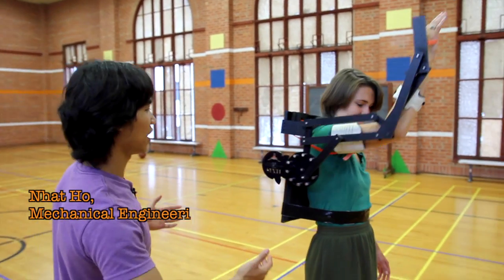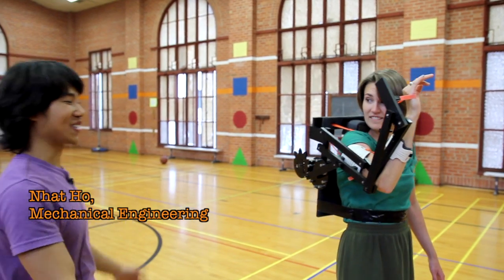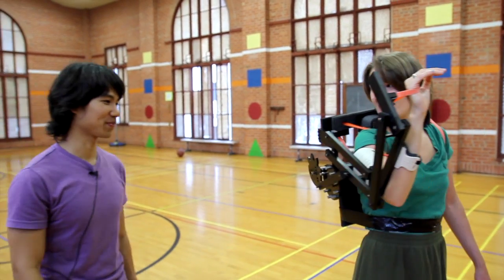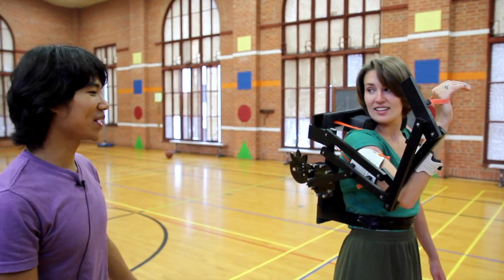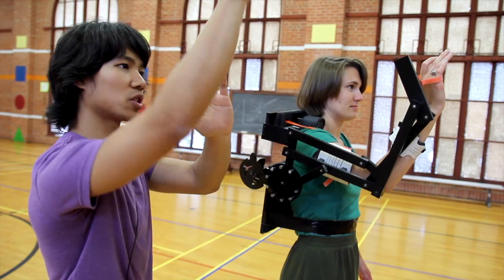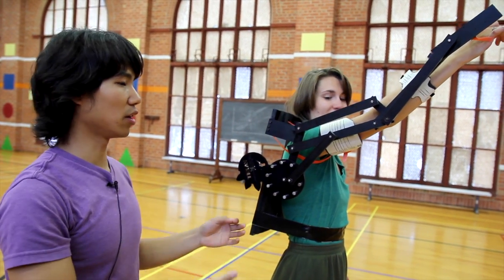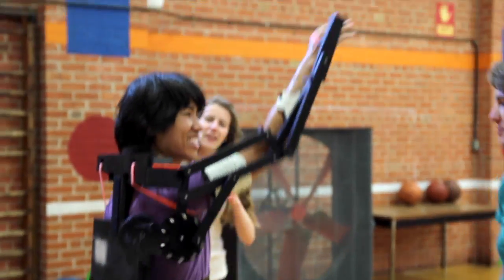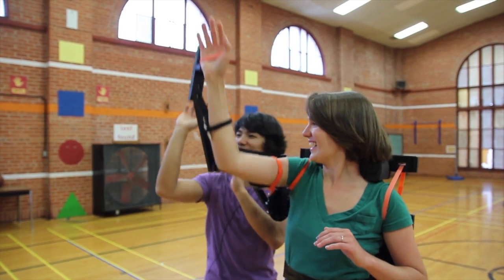What we have here is what we call the exo-baller — kind of a mixed mashup of exoskeleton and basketball. It actually restricts the user's hand into one motion, which is the shooting of a basketball, and it will continue to repeat that motion to help the person build the muscle memory to learn how to shoot a basketball.